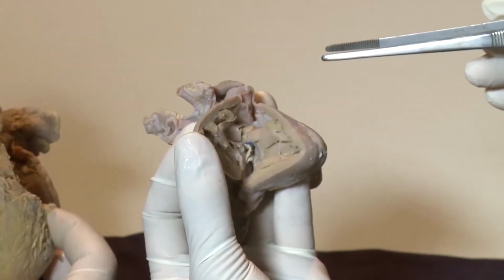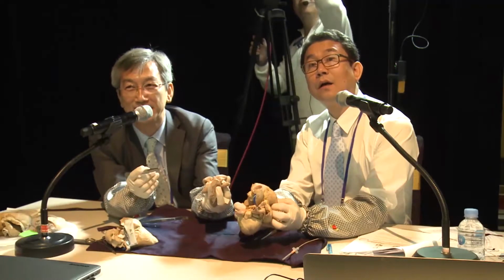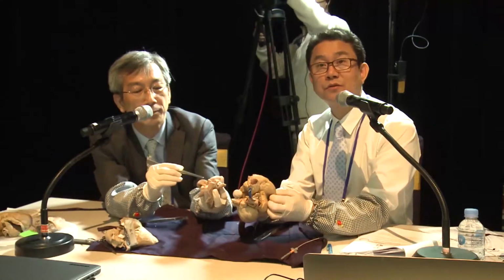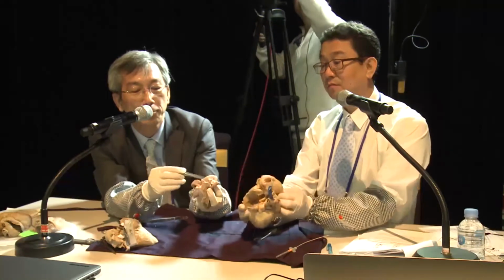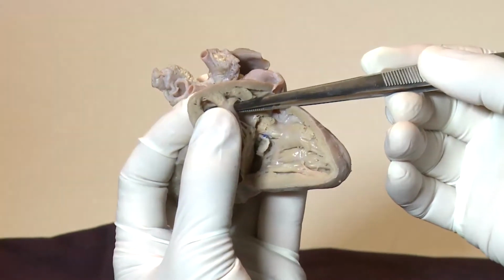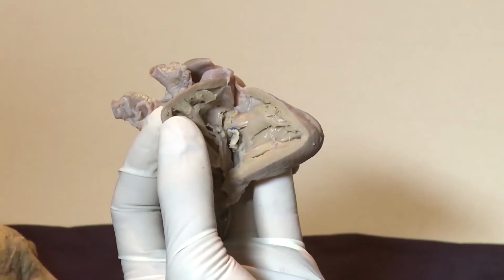Not danger. What happens is when you cross, sometimes you cross with the wire too deep in the ventricle, and you get caught in the moderator band. And you have to restart the whole procedure. Not only the moderator band, but the anterior papillary muscle itself can block and trap the device within the right ventricle. But the interventionist should have a technique to withdraw the device.